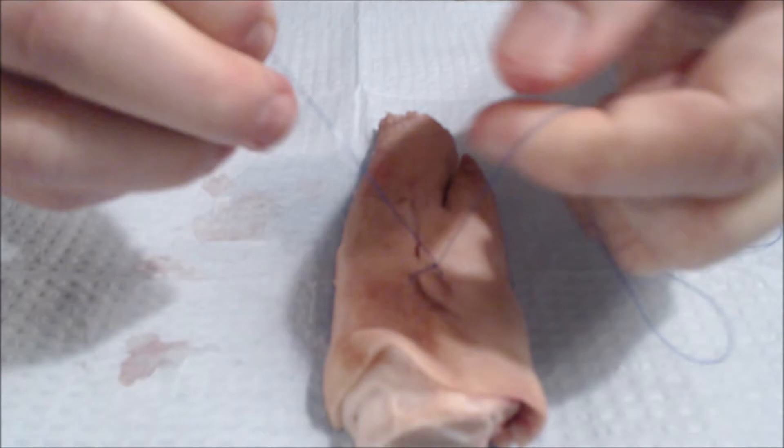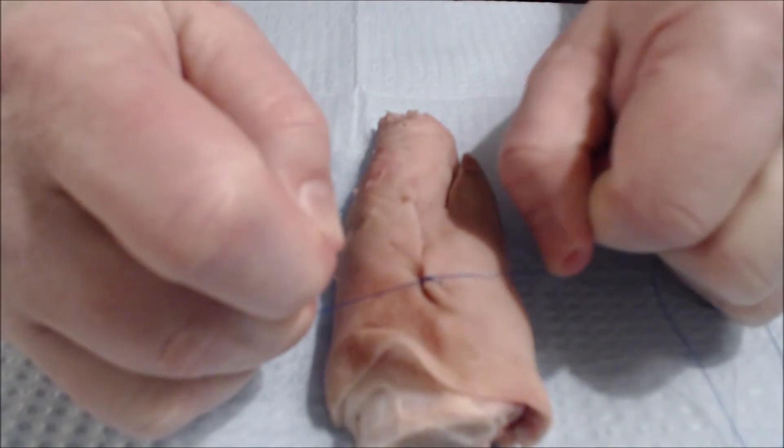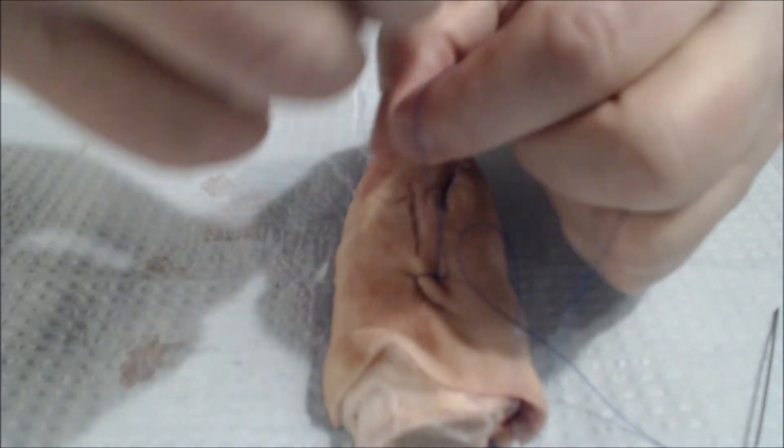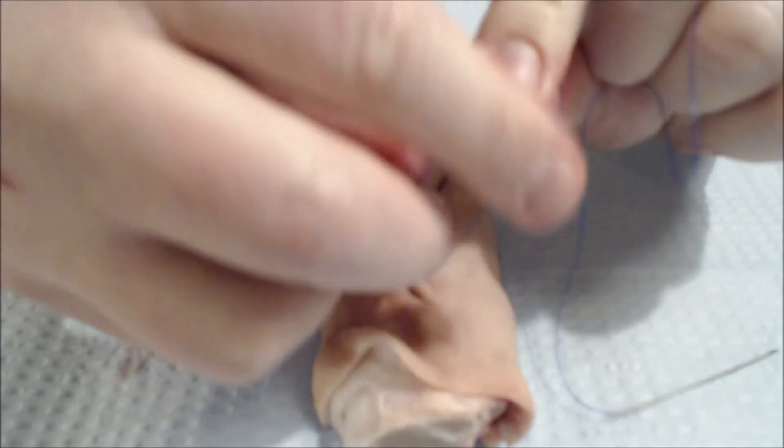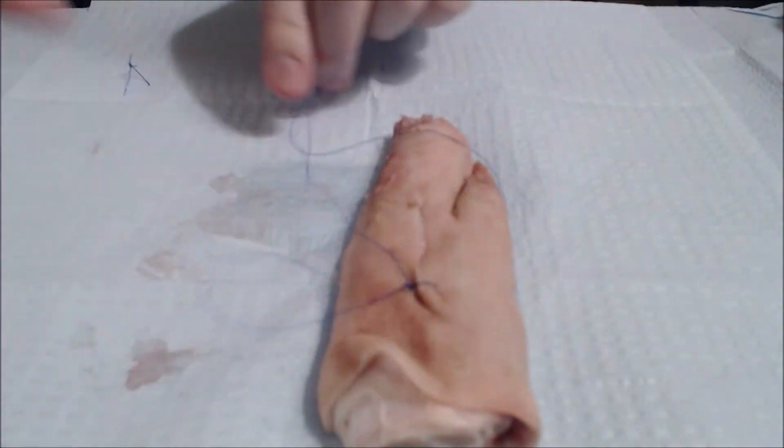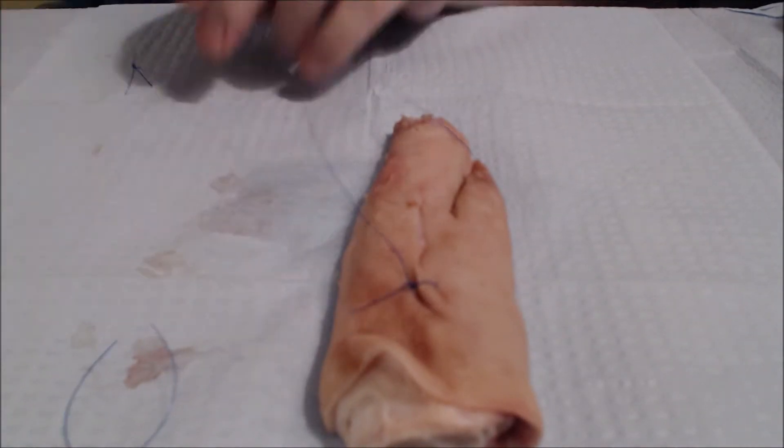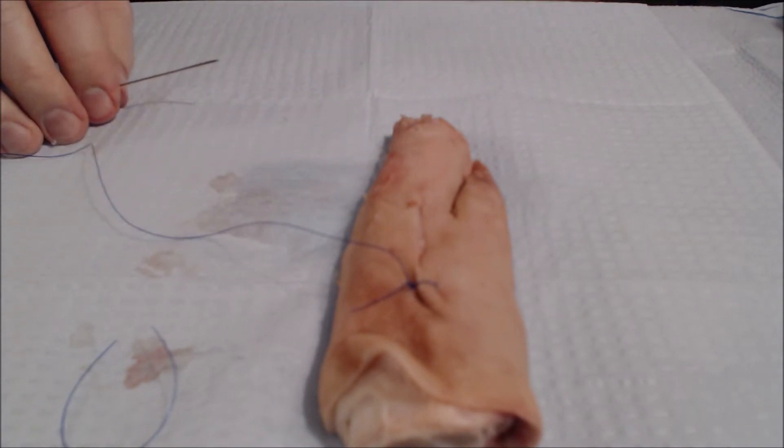We'll tie it in the usual way, which in this case is not very good because the material is so slippery, much like fishing line. Once we've done that, pull this over to the side we like best. We'll trim the end a bit and now we're going to run the suture just as we did before.